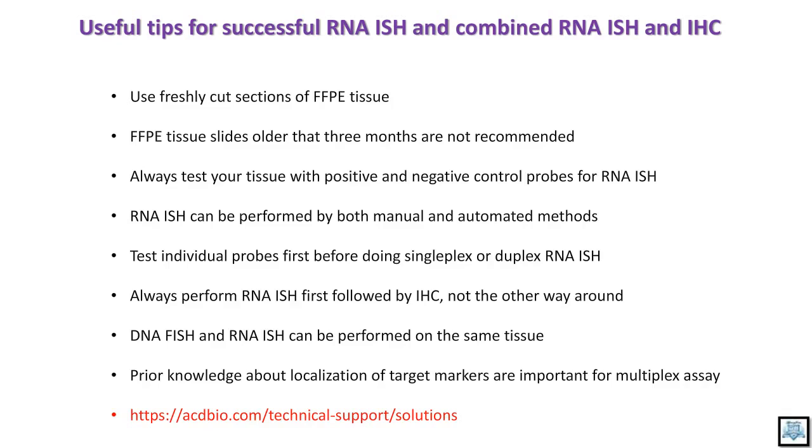Another important thing is to have some clear knowledge about the location of the target markers. Especially when you're doing a multiplex assay with antibodies, make sure that you're expecting the staining in the nuclear, cytoplasmic, or membranous compartment. If you have a clear knowledge, it will be easy to interpret your results. So these are some of the important tips that I thought would be useful for beginners.